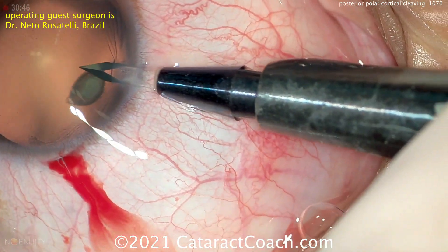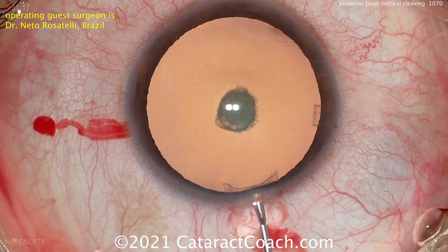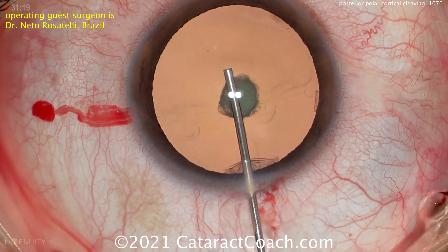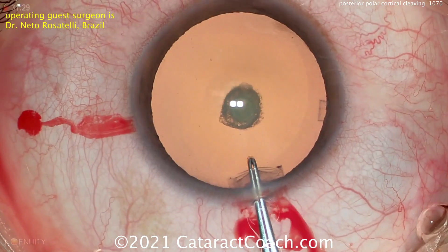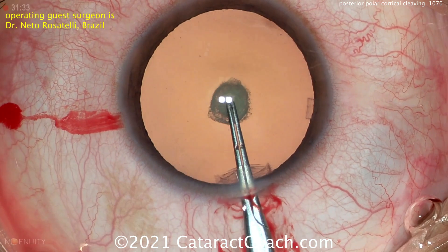It's a patient with a posterior polar cataract. We know from previously published studies from Osher and Vesavida that there is a one out of three risk of posterior capsule rupture. But let's see what Dr. Rosatelli does differently.